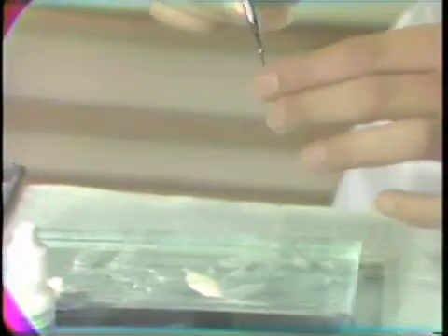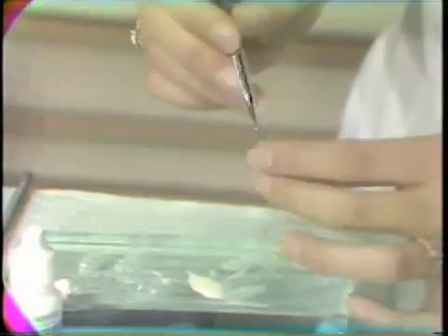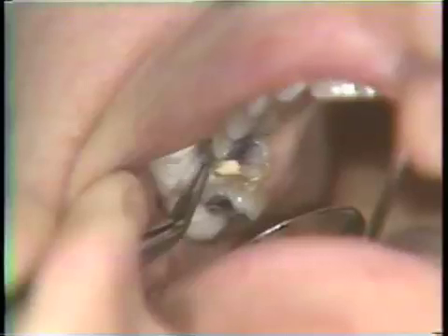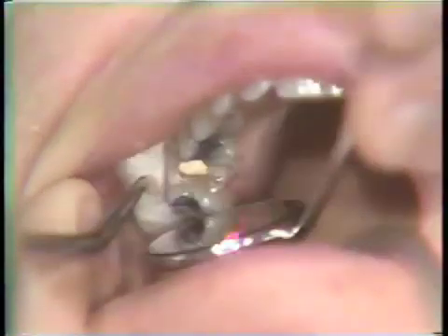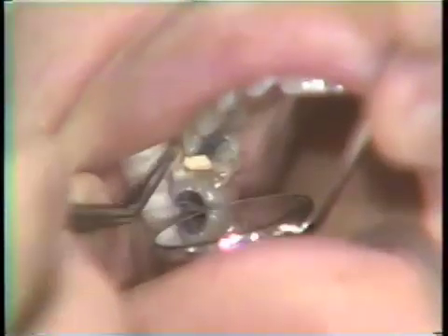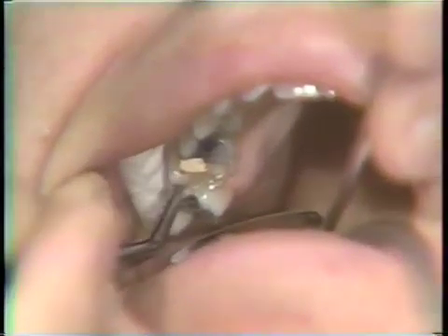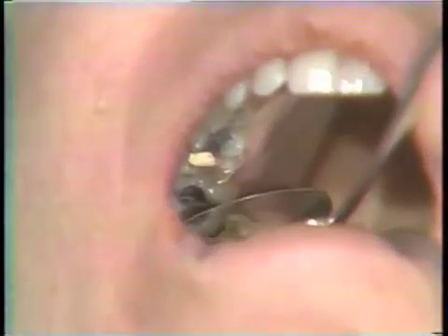While the cement mixing is being completed and the cement is being placed as a lining into the casting, the cavity varnish is placed on the prepared cavity. A moment of drying takes place and another coating is placed, so that there are two thin coatings of varnish placed on the prepared cavity.